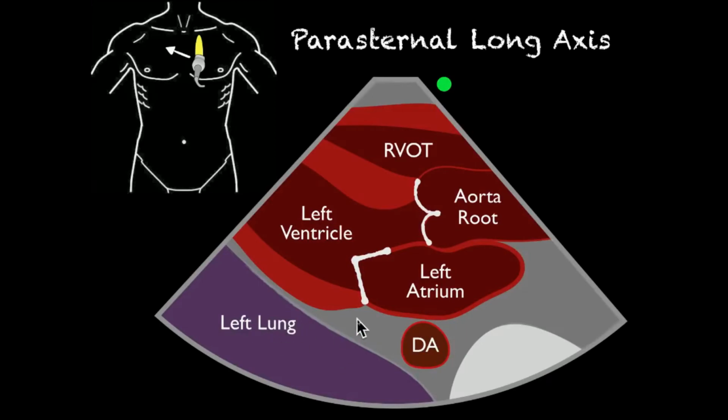And I like to think of it this way: look at where the arrow is pointing if you're struggling to remember what things are. So look at your big, meaty chamber of the heart, and that's typically going to be your left ventricle most of the time, unless they have other pathological issues. And then just look where arrows point to and from it. You've got your mitral valve that's going to be flapping into it or pointing into it, and you know that blood's going to be coming from the left atrium. And then you'll see an arrow kind of pointing out and away from it, and this is going to go to the aortic root. Just knowing that, you already have 3 of the structures defined.